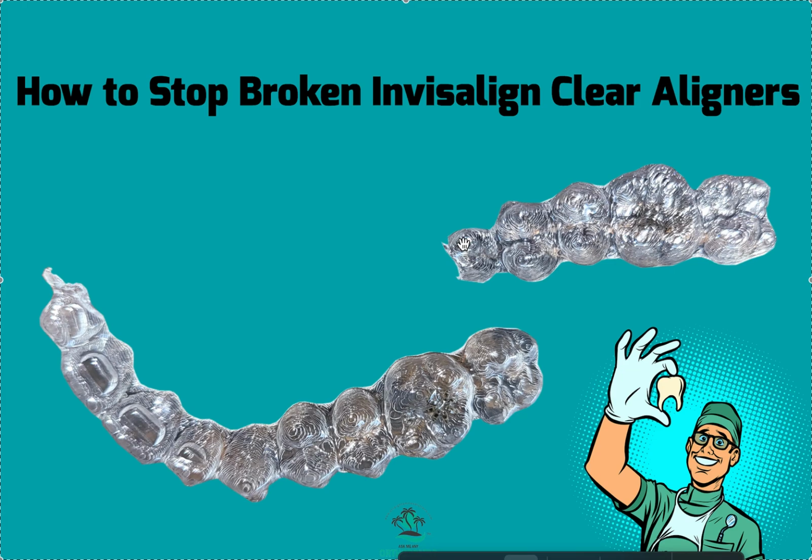But usually the first thing I look at is where was the breakage. Second thing I have them do is put the aligners back in and see if it was even tracking. Because if it wasn't tracking, then it's time for you to do a refinement anyways.